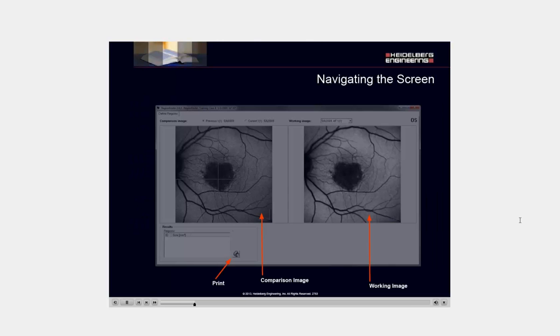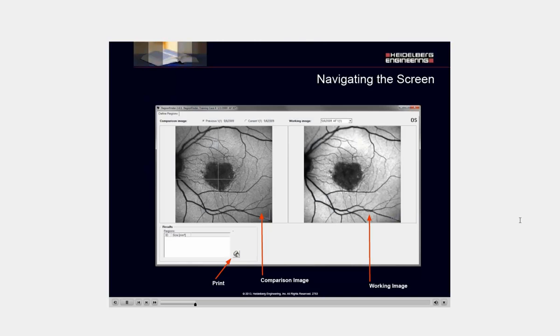For an initial exam, you have your working image on the right, a comparison image on the left, and a button to print your regions on the bottom.